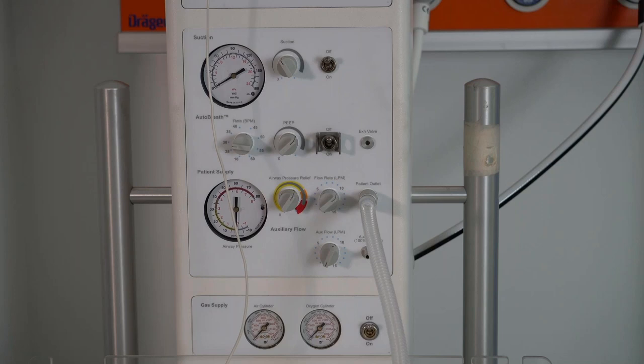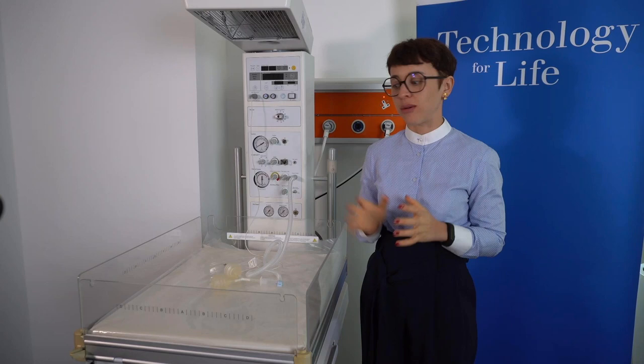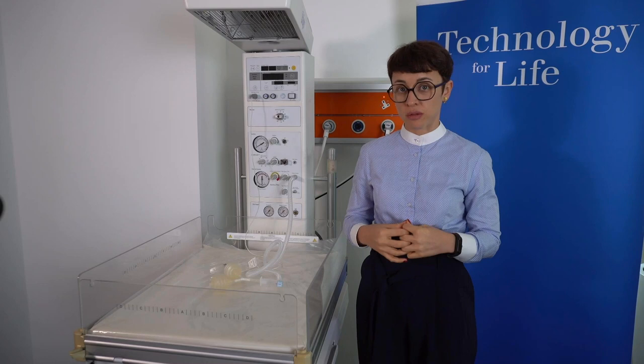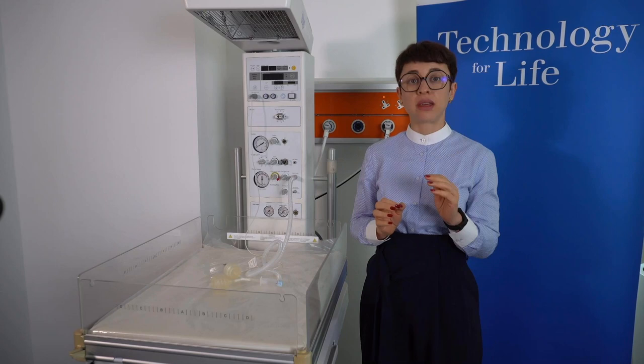So I hope you can see the screen and you can see the device. So once again, my name is Margarita Singer, and in the next half an hour, I will take you through how to optimize the setup on the Dräger resuscitator, in order to maximize the outcome of your resuscitation. As I mentioned, this is a Dräger resuscitator. It's an open care warmer with an integrated resuscitation module.